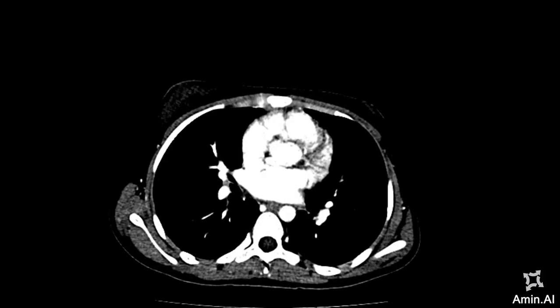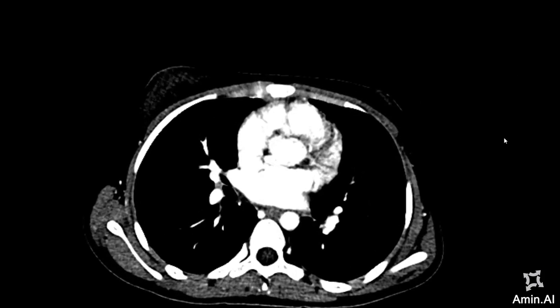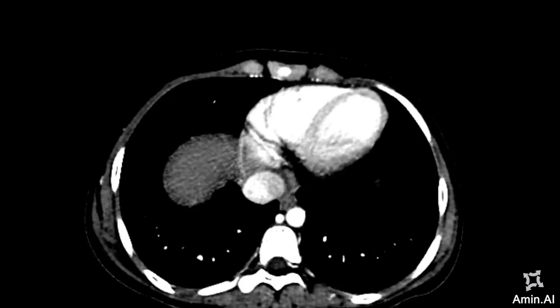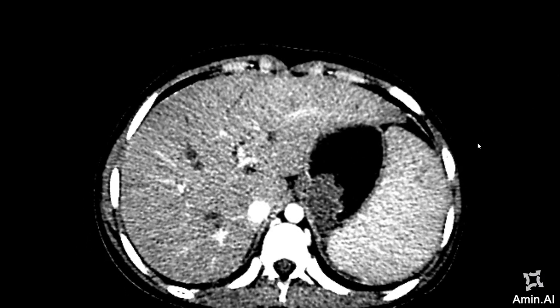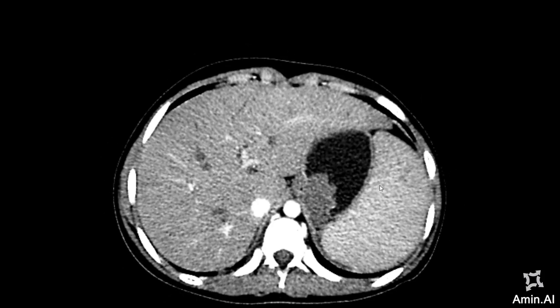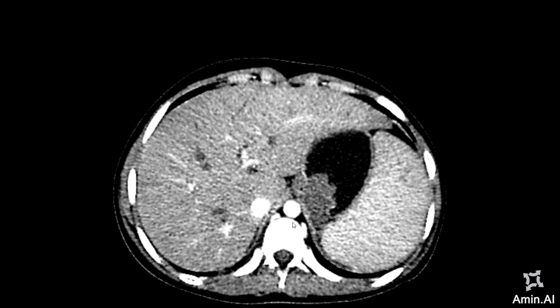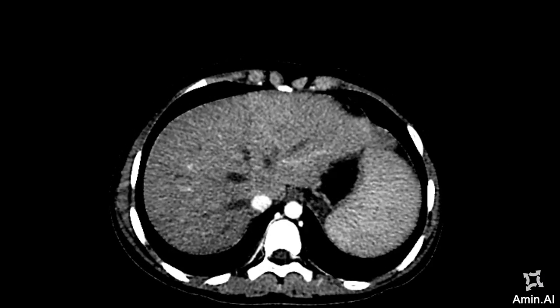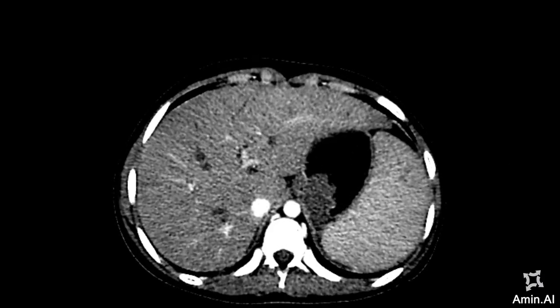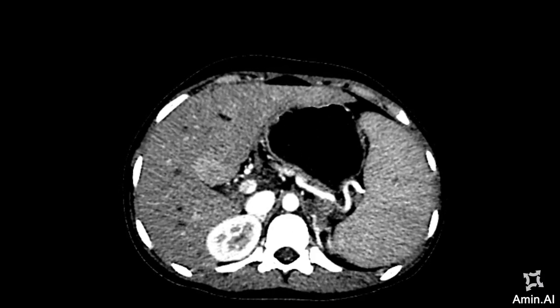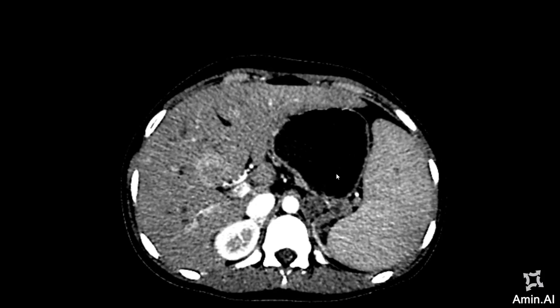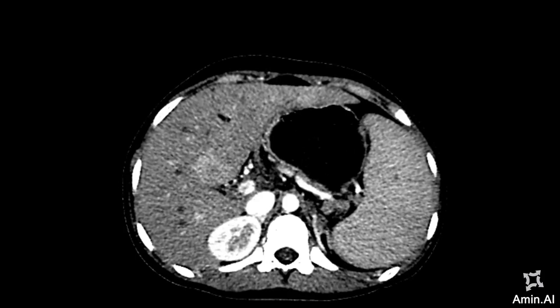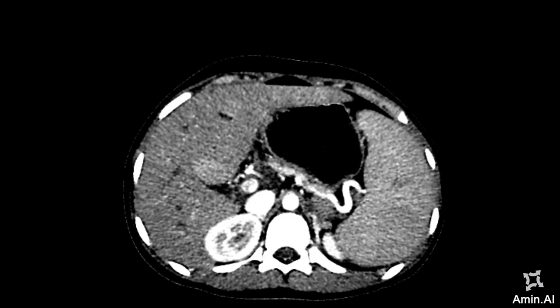I will start reviewing the arterial phase images first. As you can see, there is a lesion centered along the fundal region of the stomach, and you can appreciate this lesion in this area. On the arterial phase you can see that there is not much enhancement of the lesion, because at this time there is no significant enhancement of the other venous structures adjacent to it.